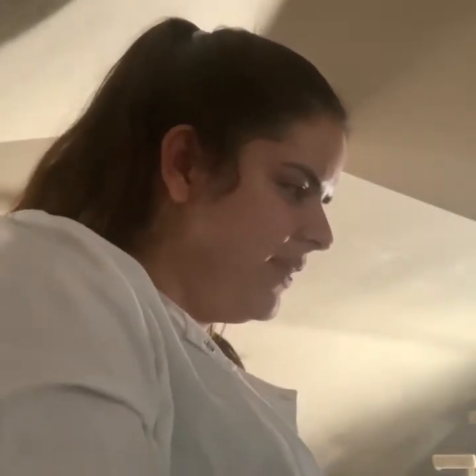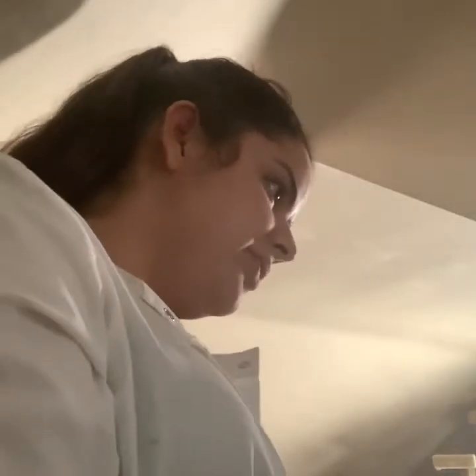Hi, this is Katie Sines and I'm going to be doing a catheter Foley demonstration today. Hi, I'm Katie, I'm going to be your nurse today. Can you verify your name and birthday for me? Thank you. Let me see your wristband. Alright, so that does verify the same information. Today the doctor has ordered for you to get a Foley catheter and that's what we're going to be doing today.